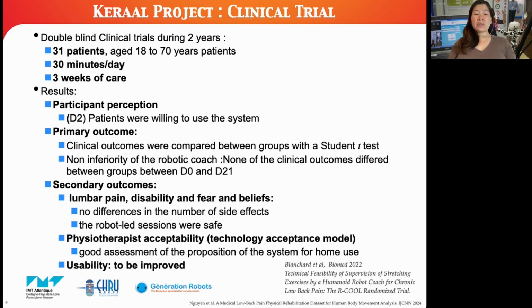In terms of secondary outcomes, we assessed lumbar pain, disability, and fear and beliefs, and there was no difference in the number of side effects. So the robot-led sessions were safe. We also asked physiotherapists, and it showed a good assessment of the acceptability of the proposed system for home use. The usability of our system will be improved in the future.